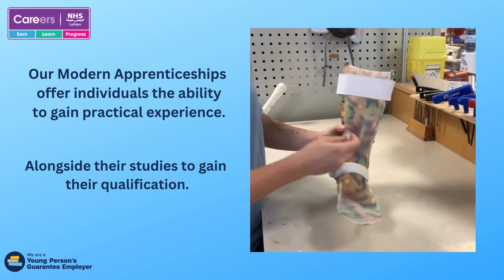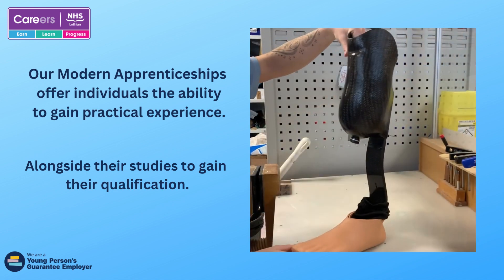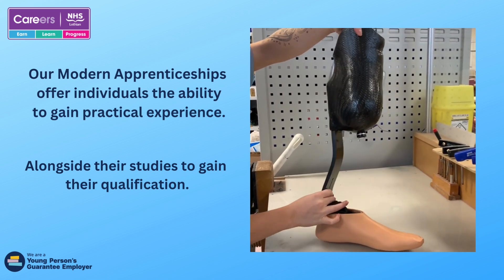In the future, I'll be moving on to prosthetics. This is a prosthetic socket which is attached to a running blade and has a carbon fibre finish.